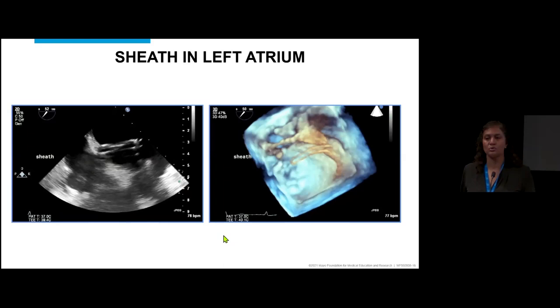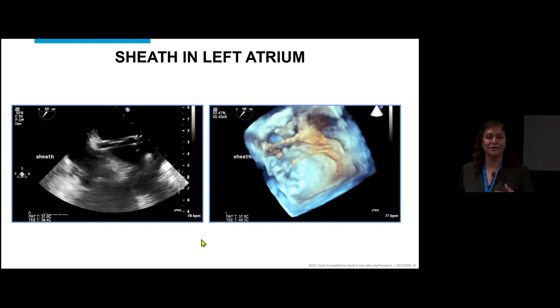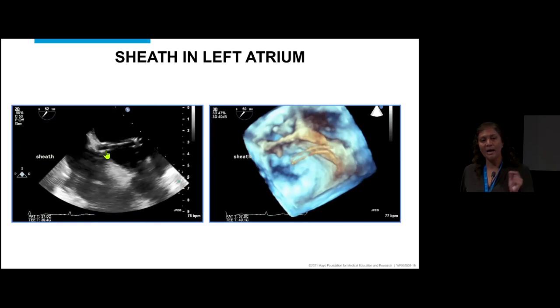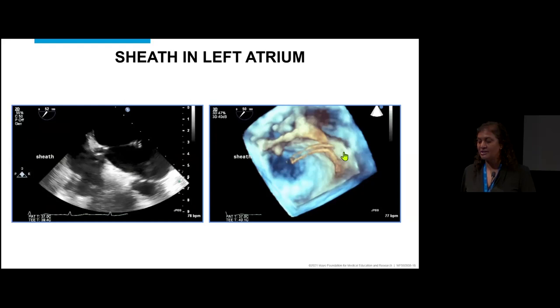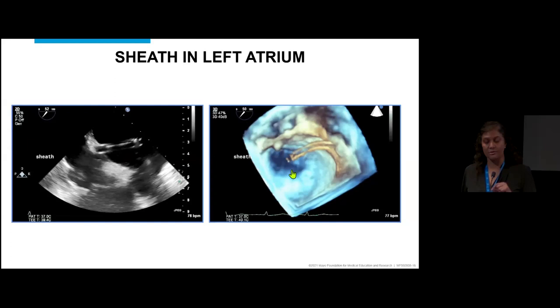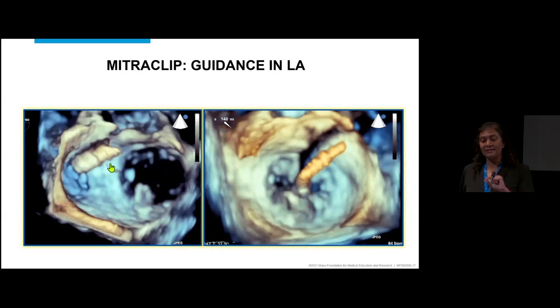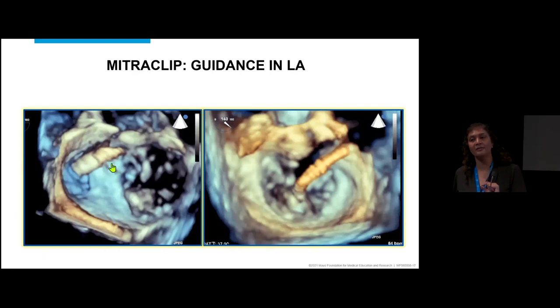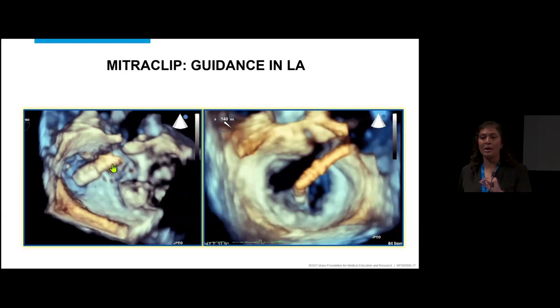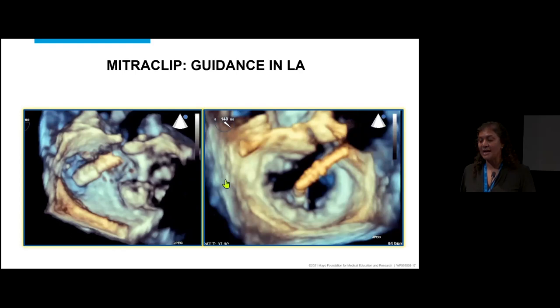During the procedure, we flip back and forth between 2D and 3D imaging. We pop across the fossa, put a dilator in, then the sheath goes in. On the surgeon's view, you can see the sheath coming across the atrial septum heading down toward the valve. As the clip comes out of the sheath, we watch to make sure it's not abutting against the lateral wall of the left atrium, and that it's free within the middle part of the LA.